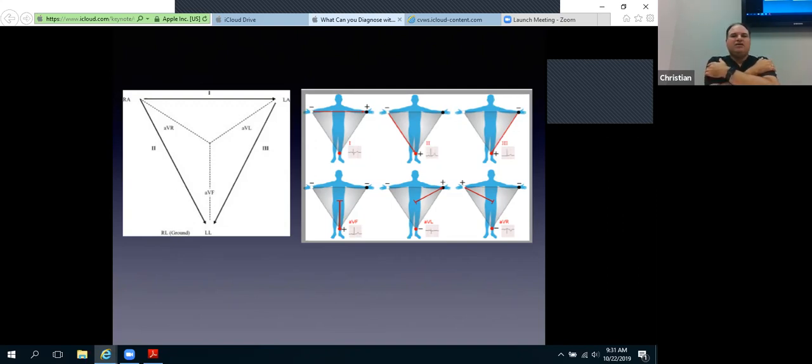And the lower limb needs to go just south of the hip joint. There is some data that suggests that there's less variation by putting it on the very lower quadrant of your abdomen, but for technical purposes and really for diagnostic purposes, below the hip joint is where it needs to be. So it's really not that difficult to get that little bit further. And so that's the first part of just like, how do you get the limb leads right?